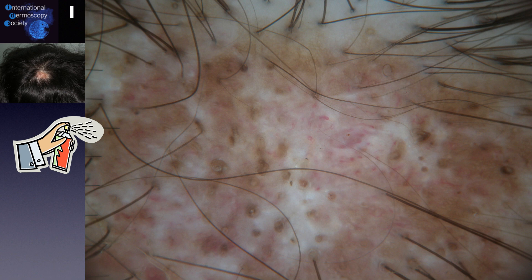From tricoscopy with immersion fluid, the scales disappear and we can better appreciate the telangiectasias, the brown keratotic plugs over the whole patch, the scattered brown discoloration of the skin, and the pearly whitish areas in the center.